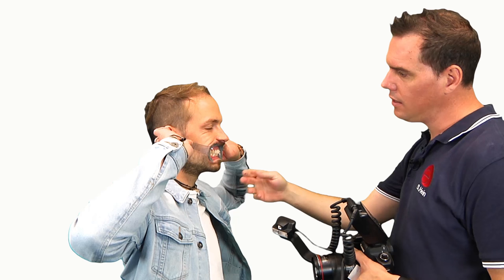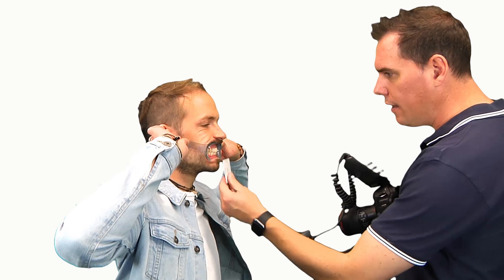Now it's perfectly retracted and the only thing we have to do is tell the patient to lower his head very slightly so you get the perfect angle. Again, move the mandible forward into an edge-to-edge position. Then you hold the grey reference card in the picture and take the shot.